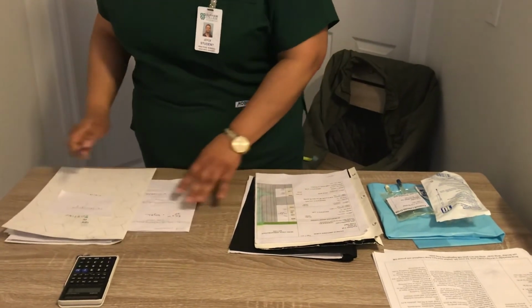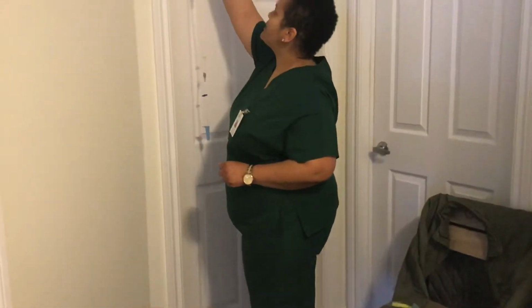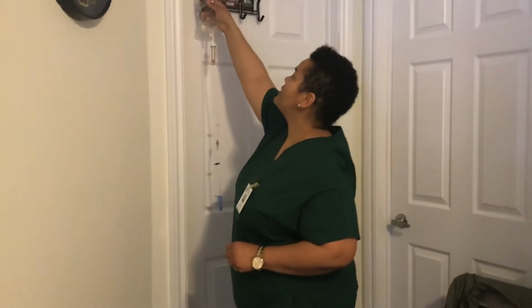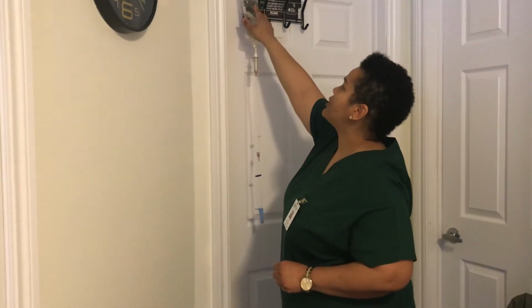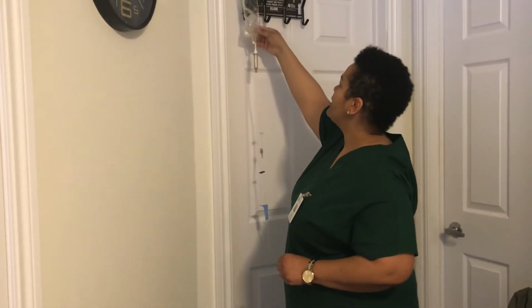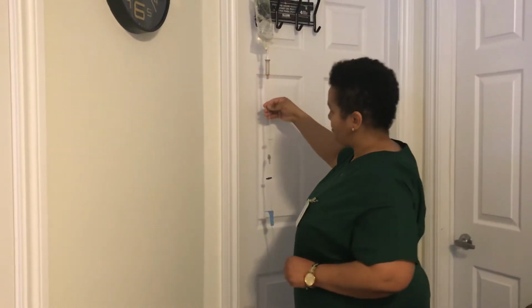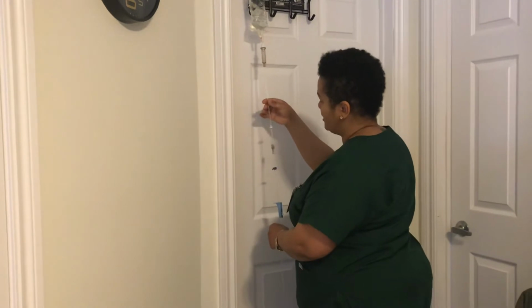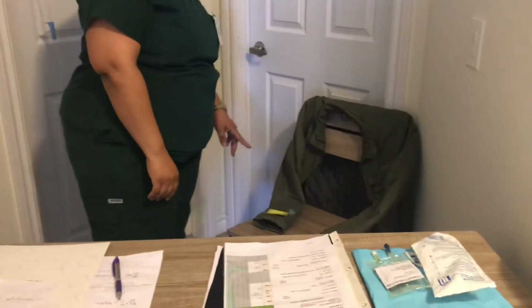So next, I'm going to assess the main line. I'm looking at the solution's name. It's normal saline 0.9%. The expiry date on the bag is January 2021, and it's infusing at the rate of 125 ml per hour. I'm looking at the tubing as well, checking for patency, no kinks, no air bubbles as well.